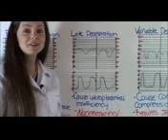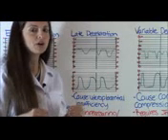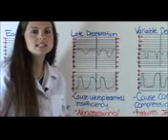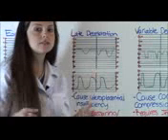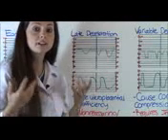Now let's go to late deceleration. Okay, in late deceleration, what is causing this? This is usually a big test question. You'll have the moms having late decelerations. What is the cause of this? The answer is uteroplacental insufficiency, meaning that it's insufficient, it's not giving the baby enough nutrients and oxygen whenever mom's having a contraction.